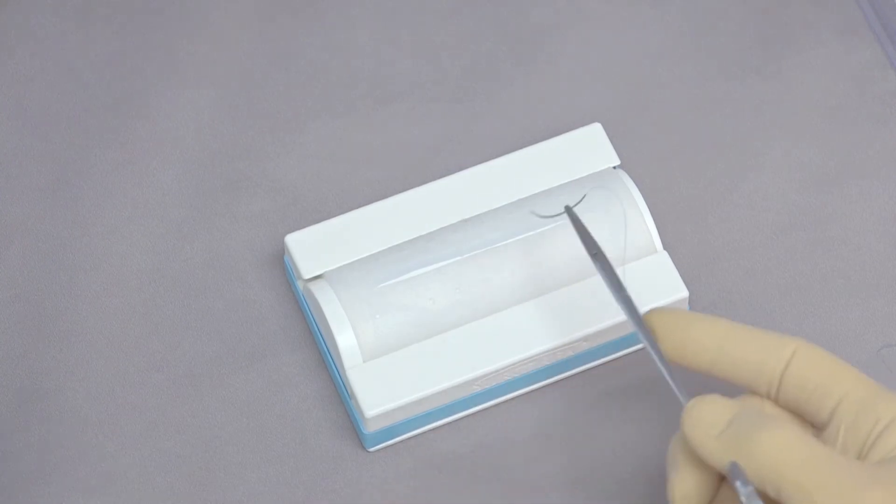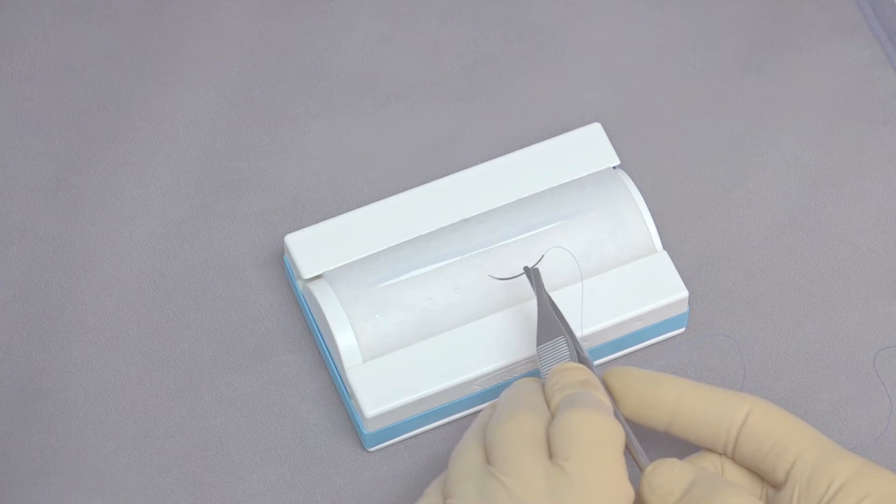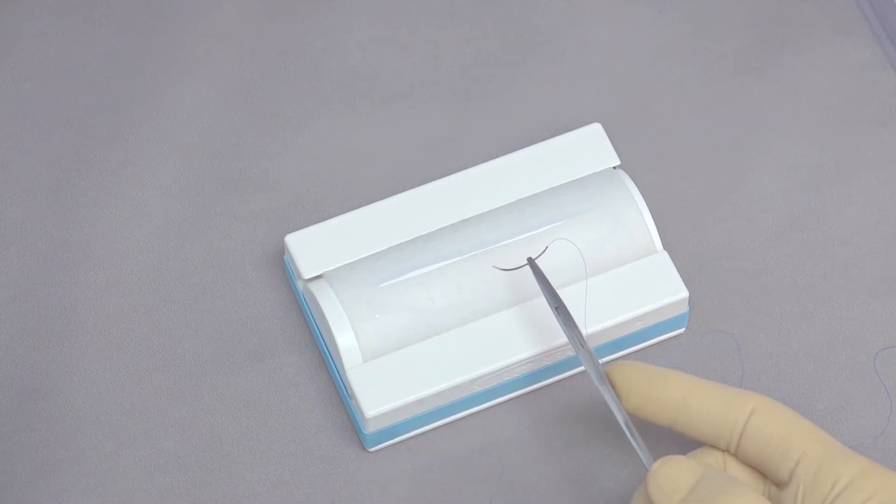To place the needle, we want to grab the needle with the needle holders just to the back of the halfway part of the needle. So you can see here the thumb forceps are about halfway, the needle holder is just past halfway.